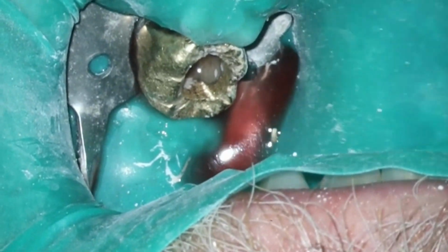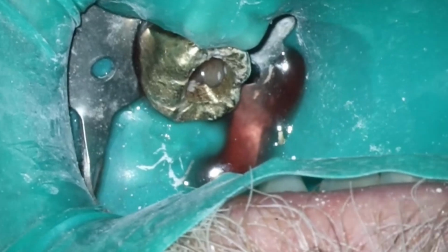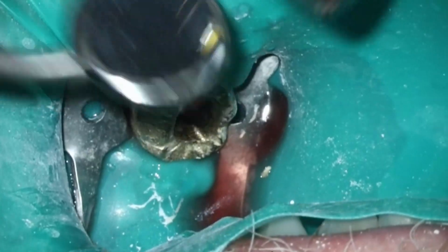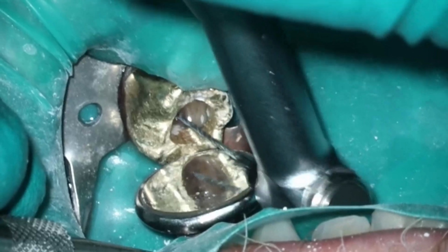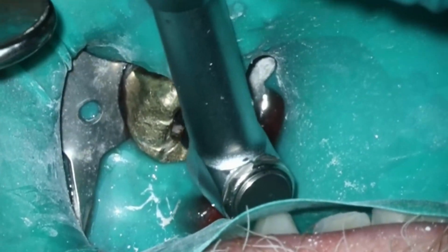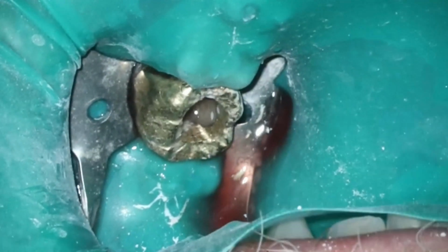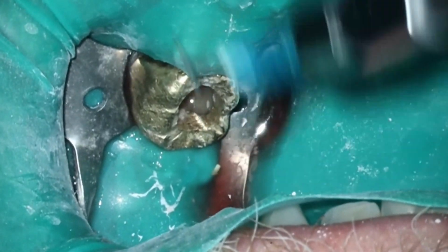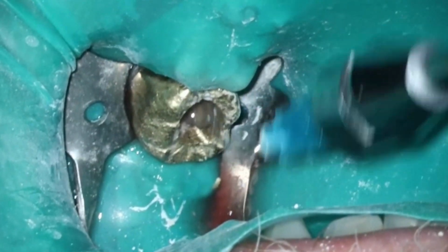Now, you can see this poor patient, all 3 canals are still very much vital. He had complete lip numbness. He had complete tongue numbness. Didn't cold test because it had already started. And once you get the coronal pulp out, they're not going to feel the cold anyway. But he was jumping the whole time. Turns out he's also anxious about dentistry. So that was a fun 1-2 punch.